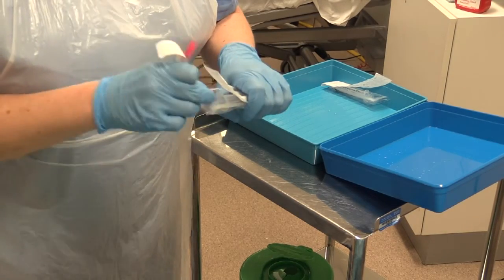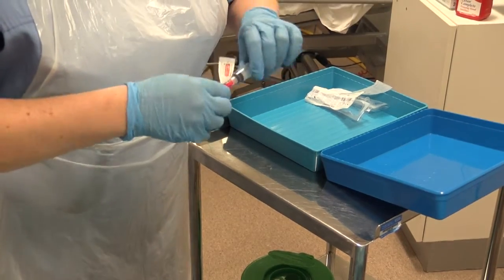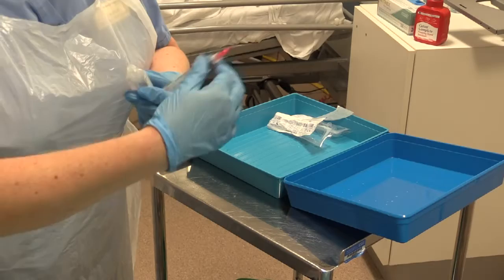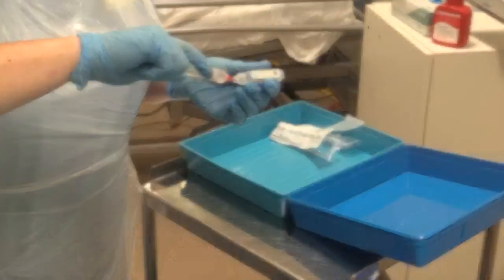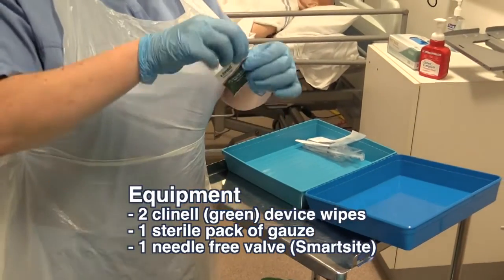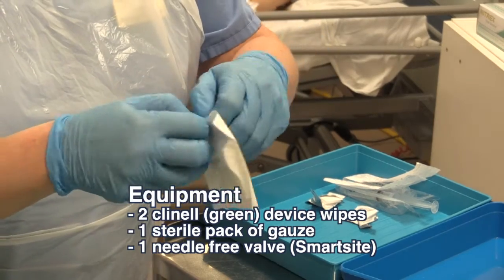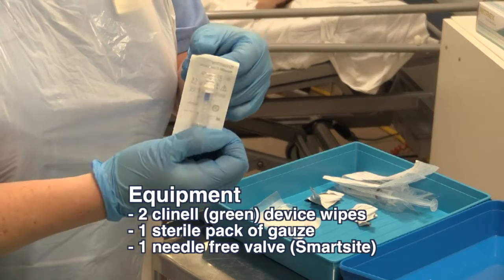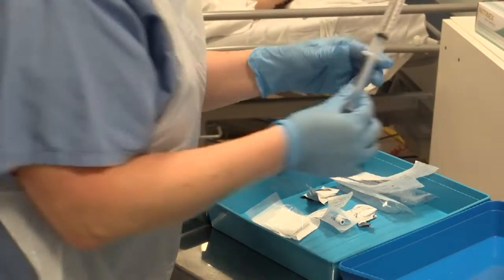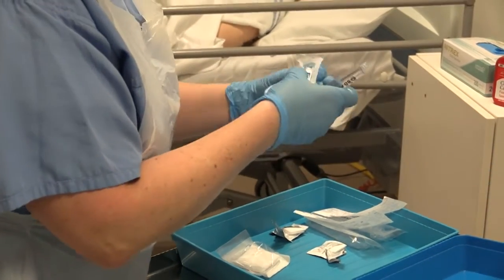Using one of the 10ml Luer lock syringes, draw up the saline using the blunt fill needle. You will also need one clinical laminate sheath, two Clinell device wipes, one pack of sterile gauze, and one needle-free valve smart sight. Using the pre-filled 10ml normal saline syringe, attach to the smart sight, priming it ready for use.